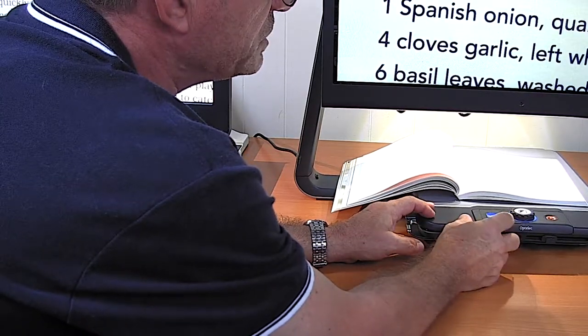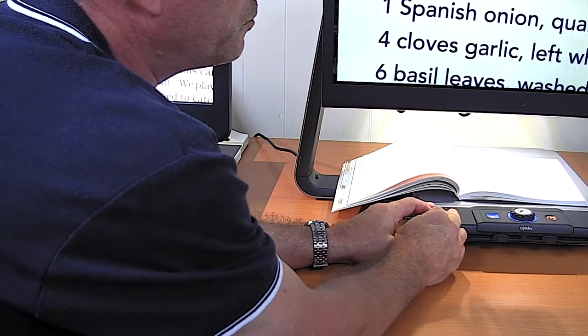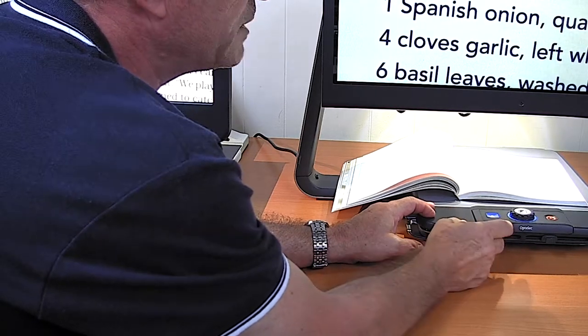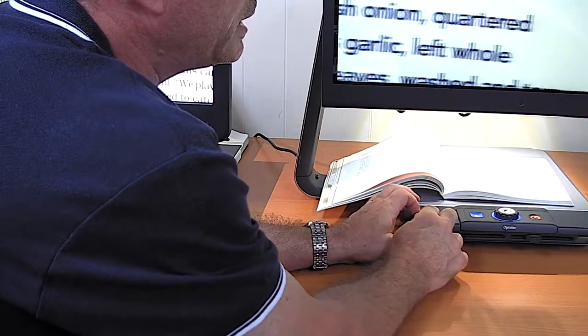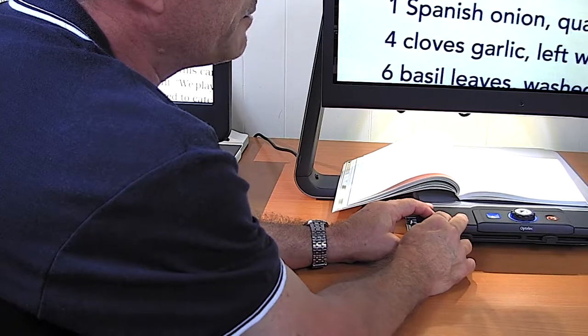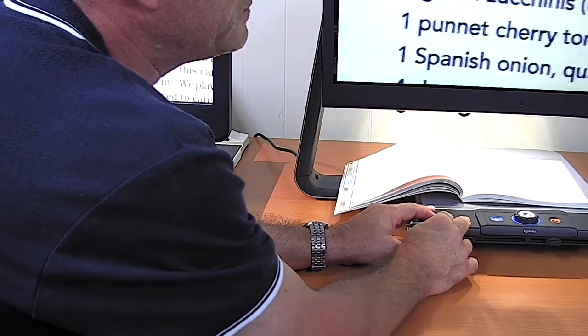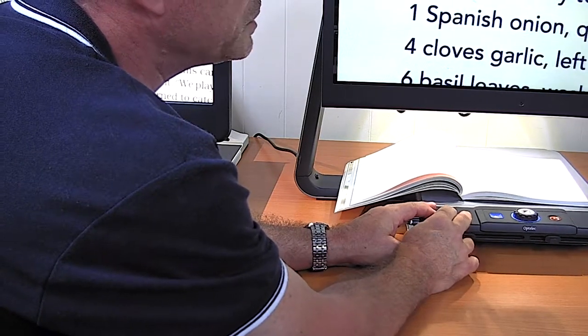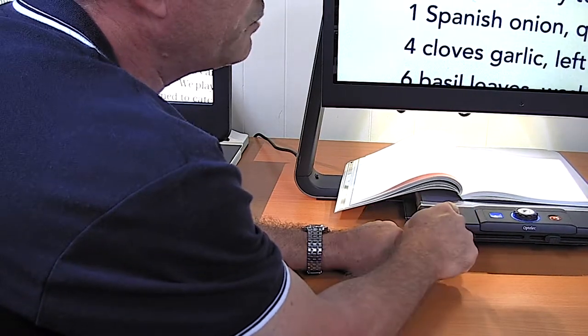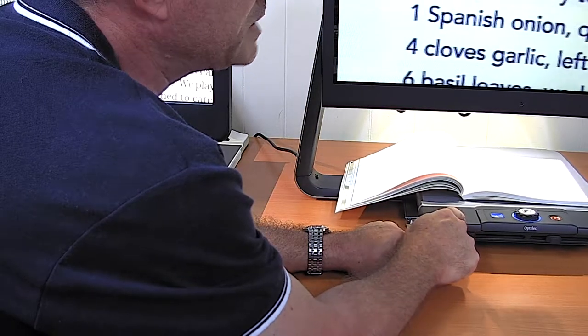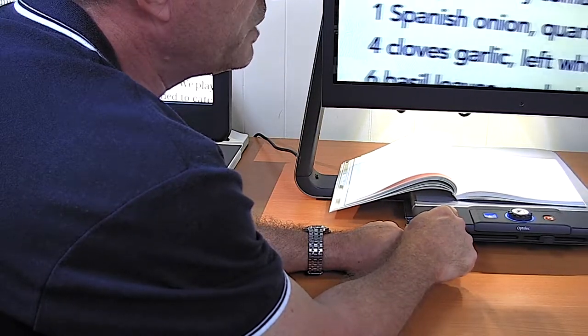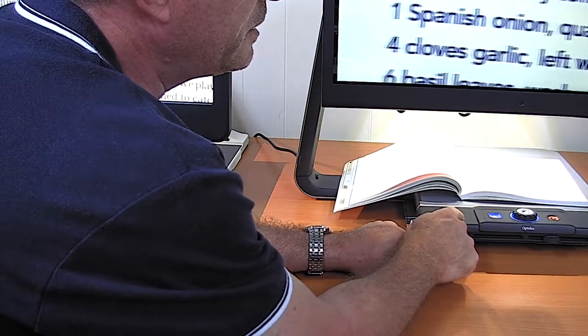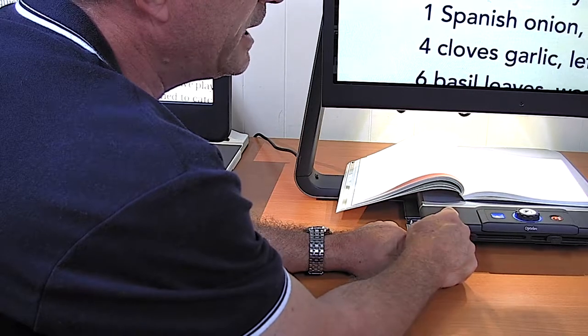The most important restriction is on the backwards-forwards motion. We can release the left one completely so it's completely free but have a little bit of tension on the back-forward motion. This way, with one finger, I can safely move left and right without any worry about it slipping up and down.